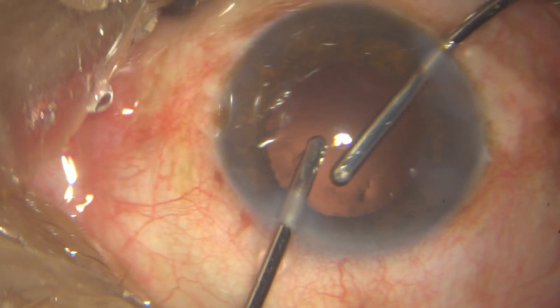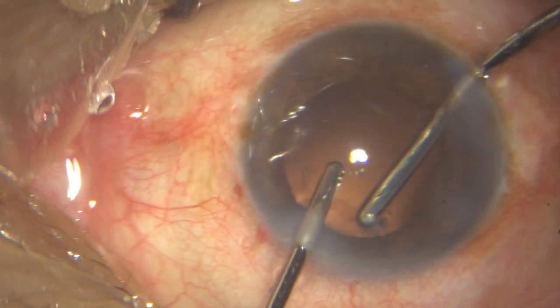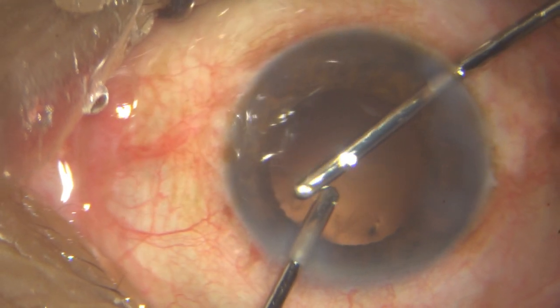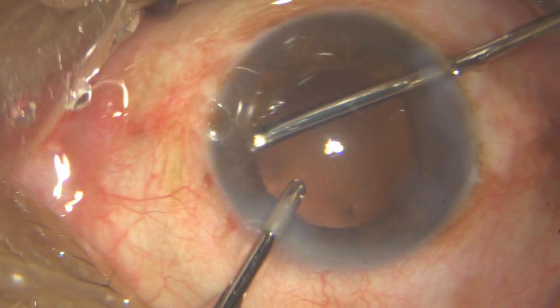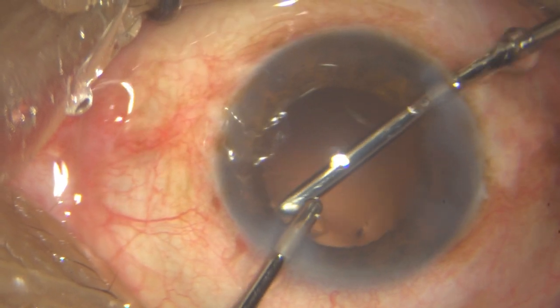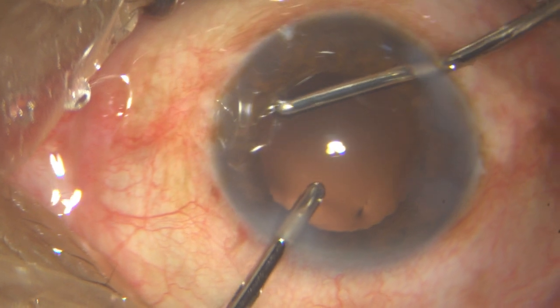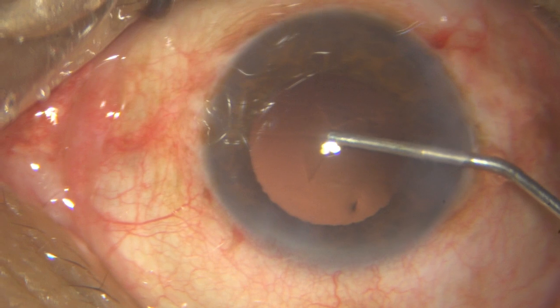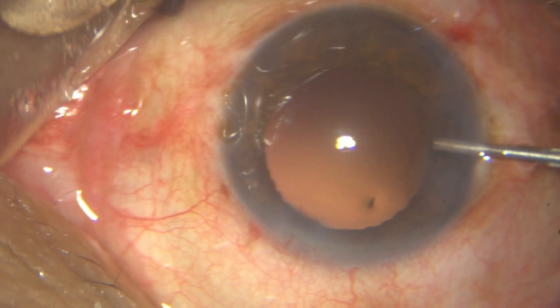And now, having done the hard part, don't take it easy, because it is at the step of cortical aspiration that you are most likely to have a PCR or a zonular dialysis. So do not take the step easy. Watch the PC carefully. In these highly progressed cataracts, the PC is very loose. There is no attachment with the vitreous face, so the capsule can just come up into your port. So be very careful. Try to face your port upwards most of the time.